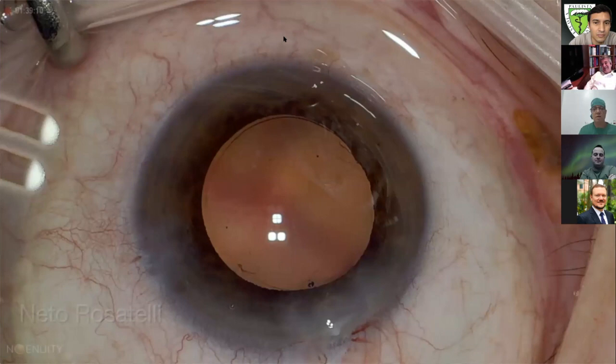Well, I'm sitting here and I'm surprised. I thought there would be much less people saying they would implant the single piece acrylic IOL in the sulcus, because it's not a good thing. I don't think it's okay. Let's wait. We're going to share the results, but there are people still voting. Okay. I think I can share, because I think they stopped voting and it takes too long. So I'm going to share the results and then you can discuss. Okay.